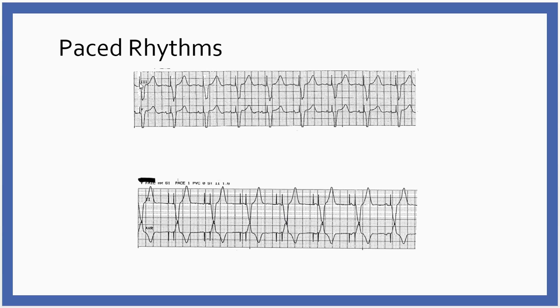And the intrinsic rhythm has to be slower than what the pacer is doing because it's 100% paced. And so the pacemaker is continuously sensing, and if there's not anything coming from the heart, it'll send out a little electrical impulse. That's our pacer spike. And then what you're going to see behind that is a big wide QRS, followed by my T wave. And that's called capture, ventricular capture.